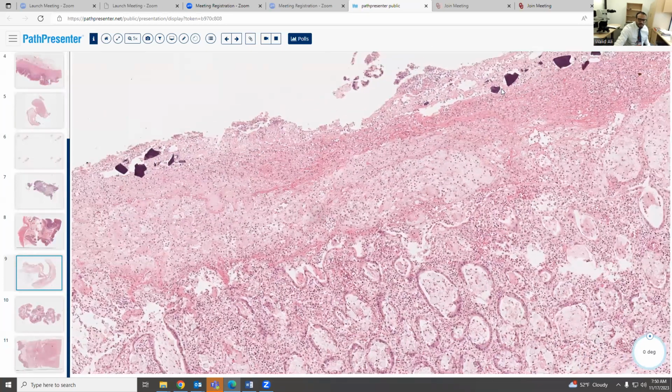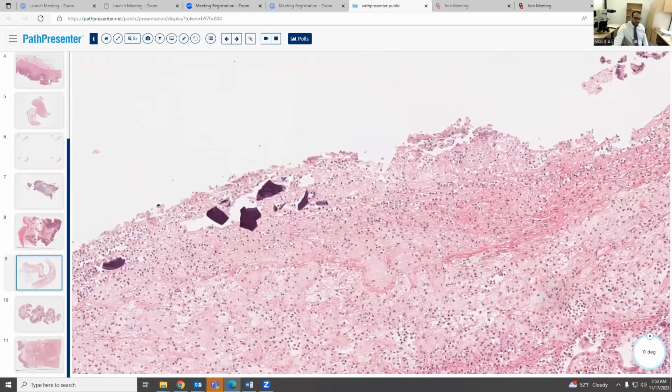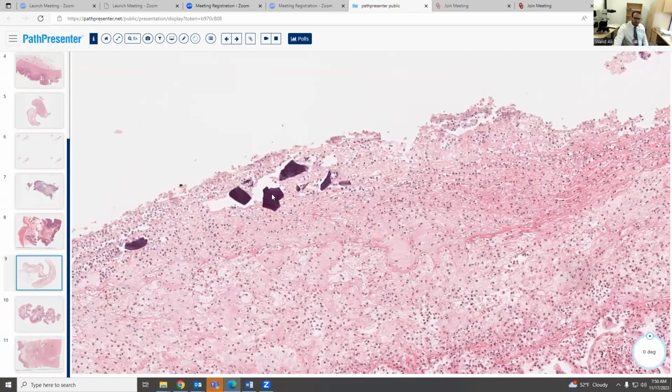It can also cause mucosal injury. It usually happens in people who are taking pills, I think it's called polystyrene. It's a medication used for lowering potassium, and some crystals in the pills can cause mucosal injury. It's called Kayexalate, and usually it's a bright purple color like this.